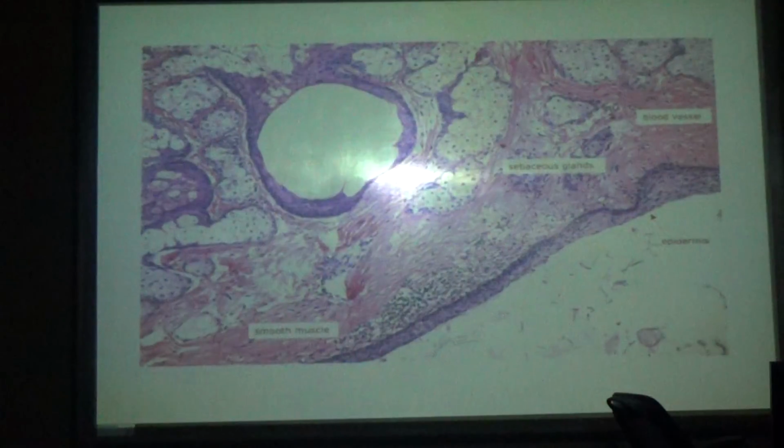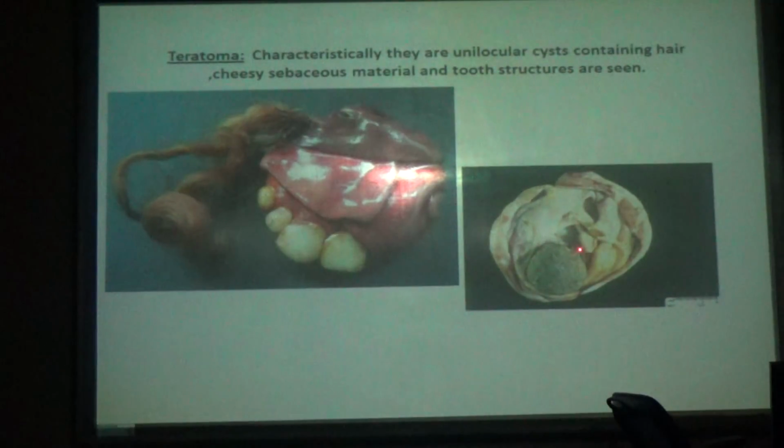I kept a few things, but many features are there. Smooth muscle cells, thyroid tissue. So we'll ask, what's the diagnosis here? Or I'll keep this slide and remove these points. Okay, it's clear. I'll keep this slide along with this. I'll just build this.